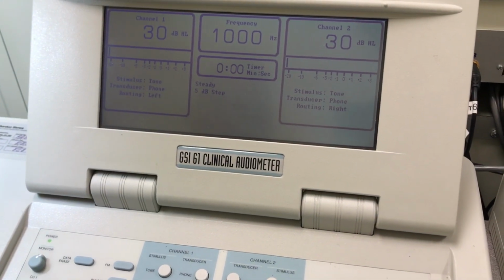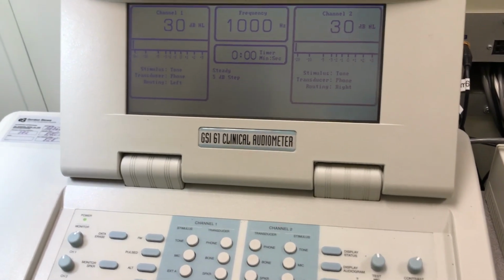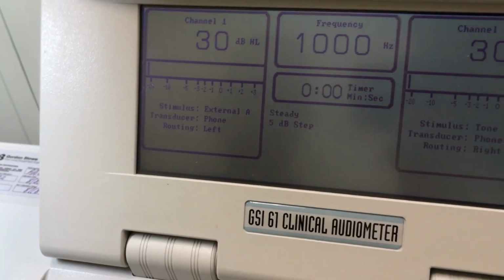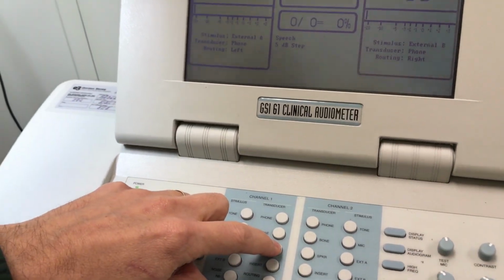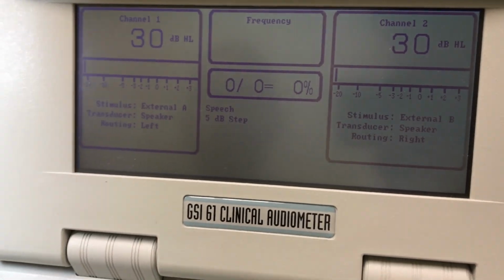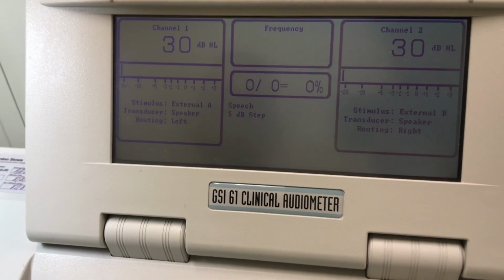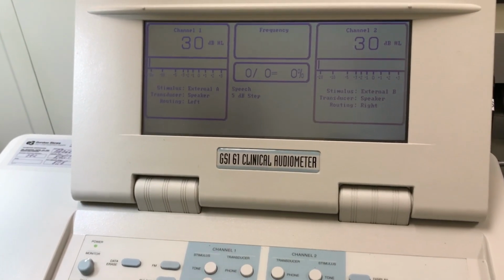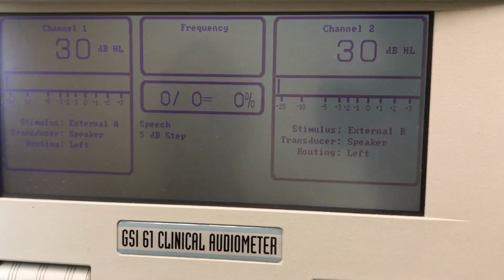Okay, the first step we need to do in equipment setup is to configure the audiometer appropriately. We want to set up the stimulus for external A in channel 1, external B in channel 2. We want to have it go through the speaker for both channel 1 and channel 2. However, we want to make sure that it's going through only one speaker. So that's going to be based off of how you have your test booths configured. In this case, we have one speaker coming out, the channel 1 coming out of the left, and the channel 2 also coming out of the left speaker.